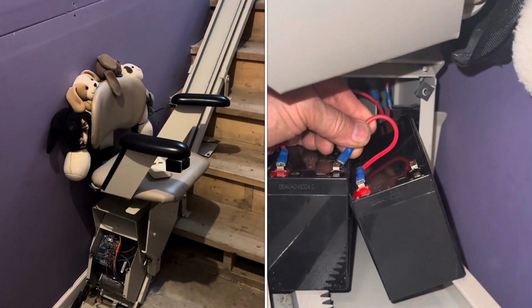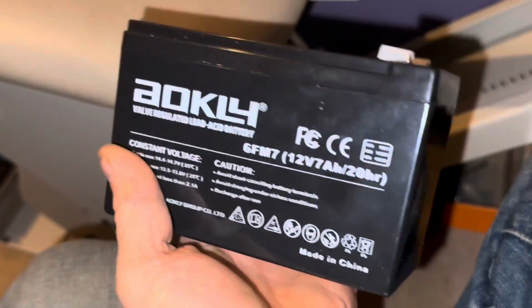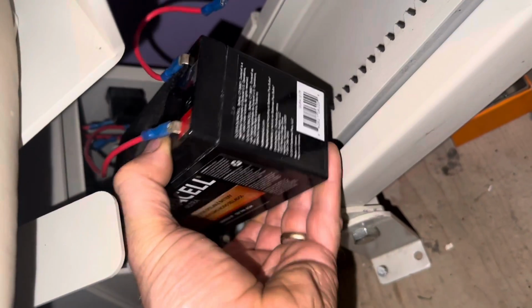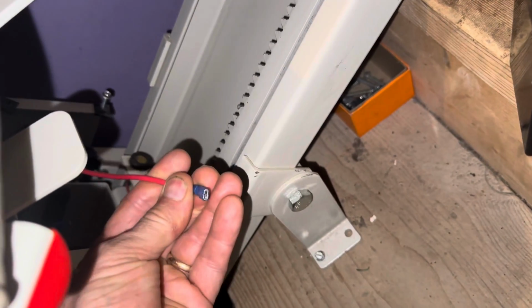We're going to install batteries on a Bruno stair lift. It takes 2 of these 7 amp hour batteries. Take out the old batteries and wire them up in the exact same way. We'll start by putting on the positive.